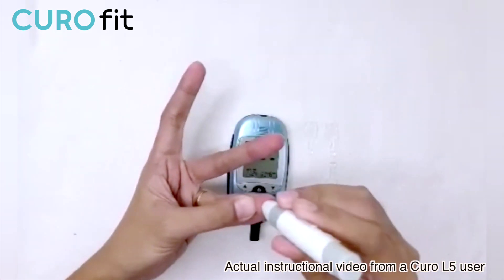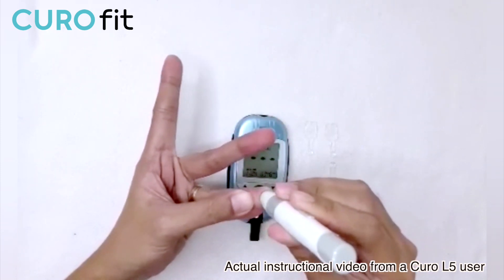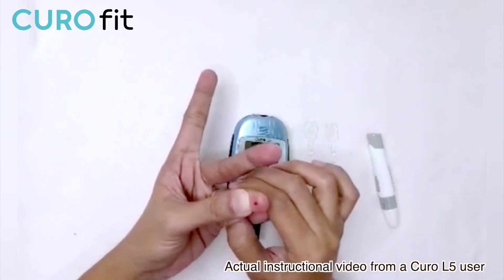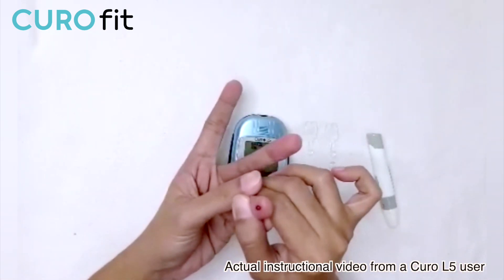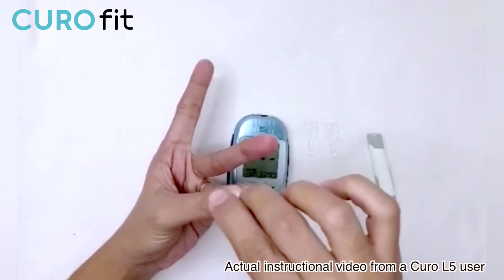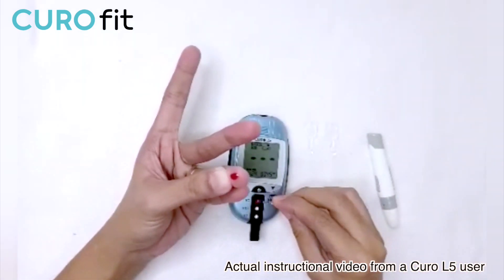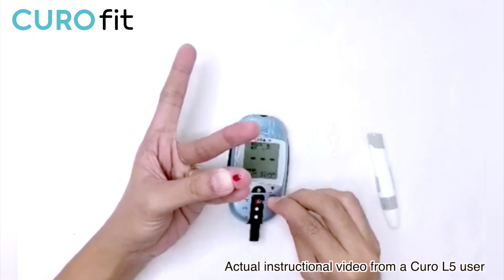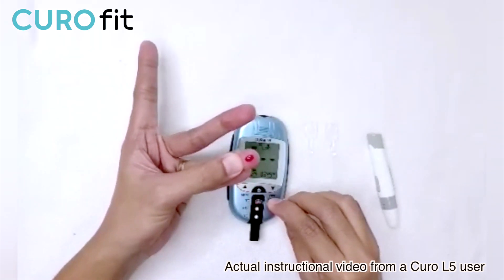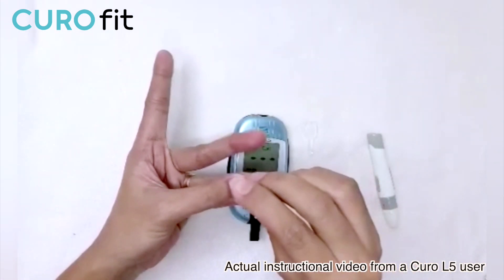To lance, just push the button in the middle of the lancing device and squeeze a little bit. When collecting the blood sample, position your finger at a 90-degree angle. Let the tip of the capillary rod touch the blood — it's actually easier to collect the blood this way. When applying on the test strip, the capillary rod should be at a 45-degree angle.